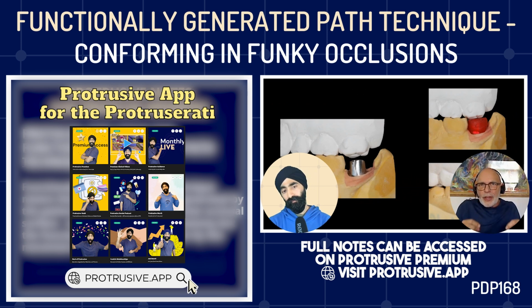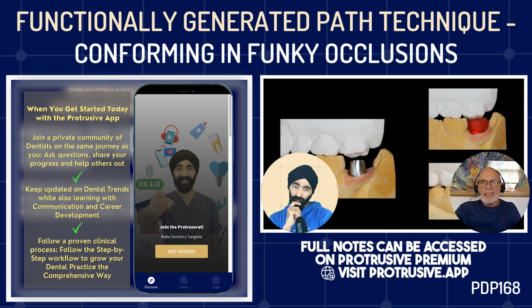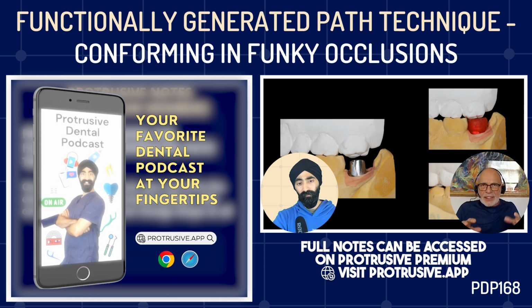That's what it means: the occlusal table is generated by the patient functionally shaping that occlusal surface. It's not just the opposing anatomy, the functional element comes from the movements. Yeah. And once it's set, there'll be flanges where they've pushed the acrylic aside. You can trim those wings away, any excess, but not the occlusal table. That occlusal table mustn't change shape at all.